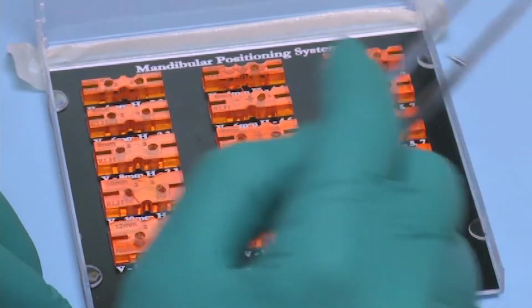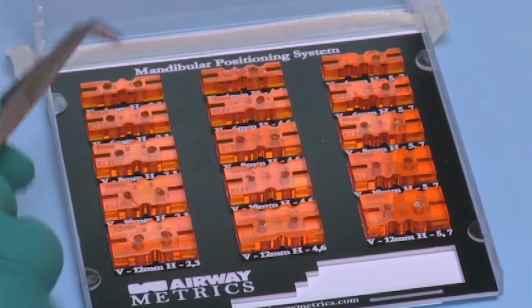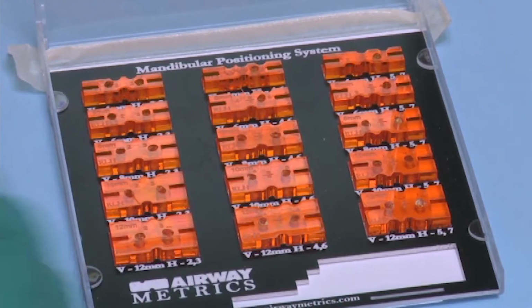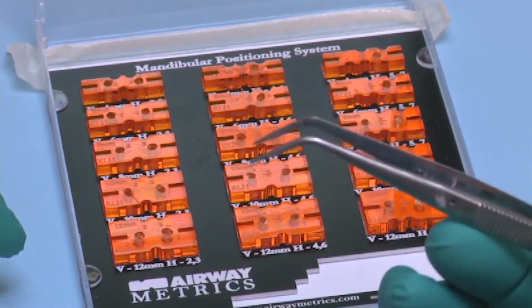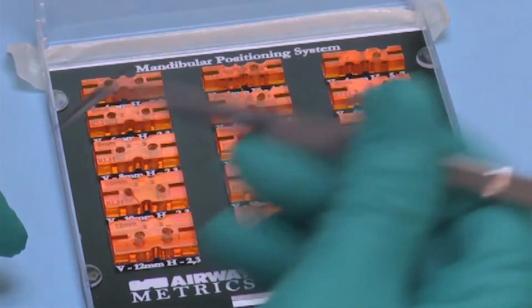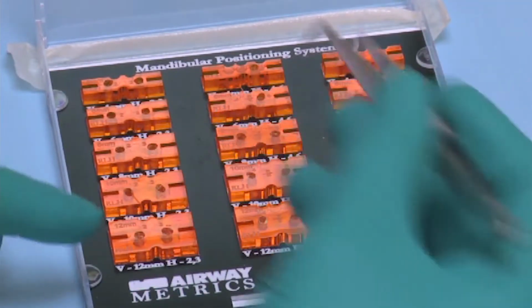So we saw that Kim responded very well at 4 millimeters. Remember that the minimum thickness that you need for an oral appliance is 4 millimeters. That's why there's a 4 millimeter key. Let's start at 6 and see what happens with Kim. And I always start 6 edge to edge because less is more. I can always move my appliance forward. You can't move the appliance backwards. They all have some type of an advancement mechanism, and we'll look at that shortly.